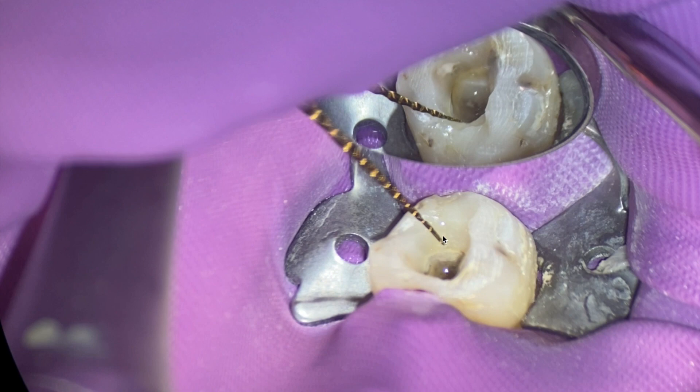So you can see here we had unwinding of the flutes. Now that's a great thing. You may think, oh no, your files — we're so close to fracture — and hell yeah, we didn't fracture. We're super close.